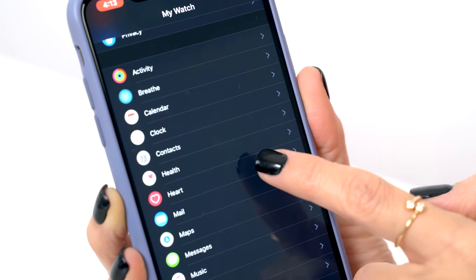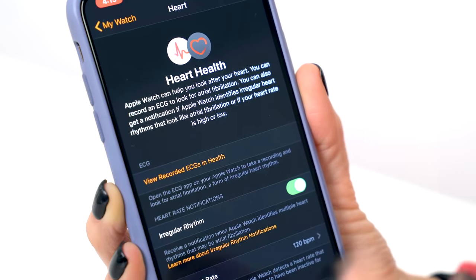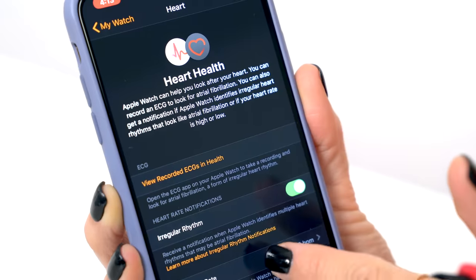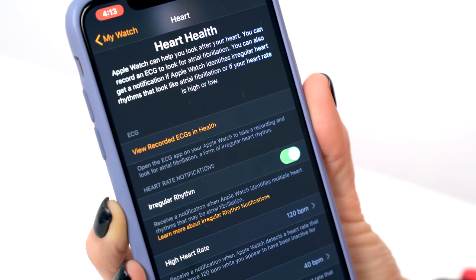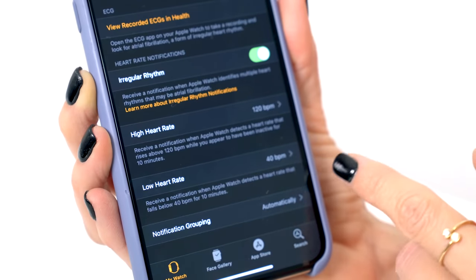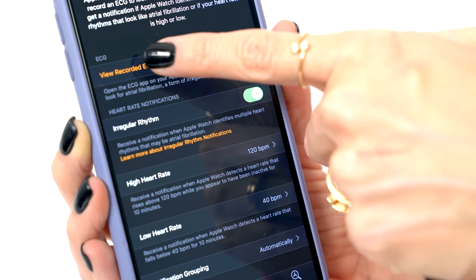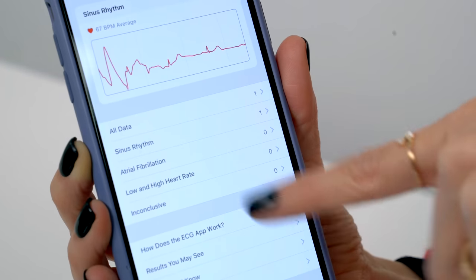So once you've updated your watch and your app, go into the heart, and this will take you into the heart health, and this will have a little setup screen — I already did it, so yours may look a little bit different. You wanna turn on the irregular rhythm, so that will notify you if your watch detects anything that's irregular. I also have on my high heart rate and my low heart rate. You can go in here and you can view your recorded ECGs and health.